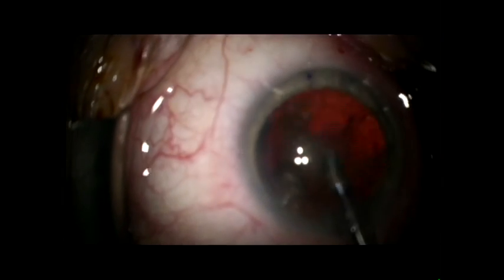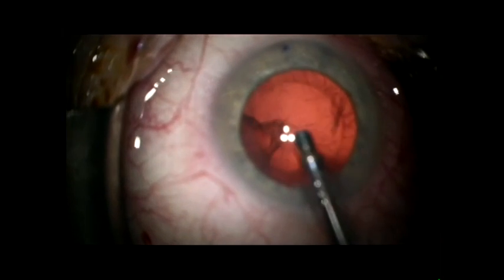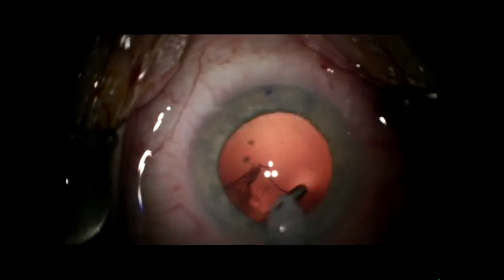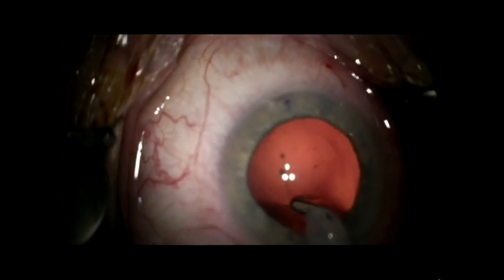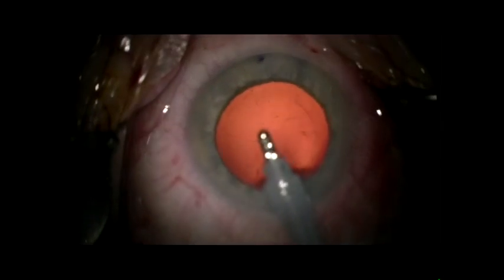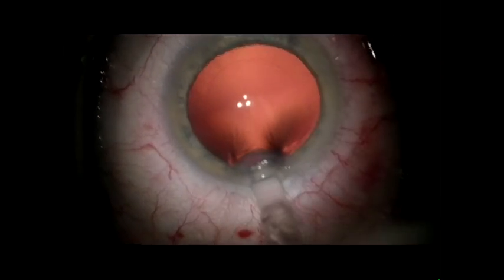360 degrees of the canal is viscodilated. Unlike the ab externo canaloplasty, however, here we do not use a circumferential suture tensioning of the trabecular meshwork or stenting of the canal of Schlem. There is also no Descemet window creation. Viscodilation expands the canal of Schlem by two to three times its normal size, allowing more flow from the anterior chamber to the canal of Schlem. In addition, it is felt that there is additional dilation of the collector channels to reestablish the flow in the distal drainage system.